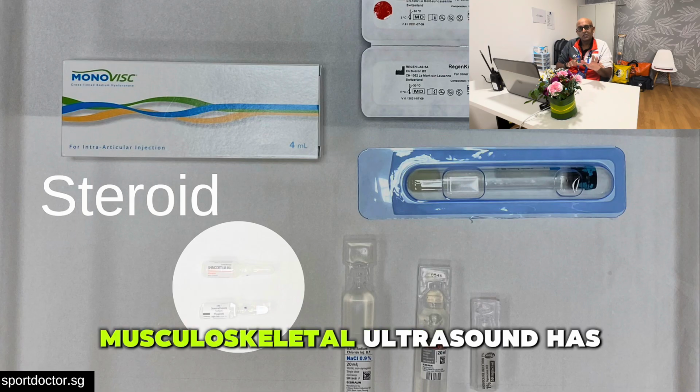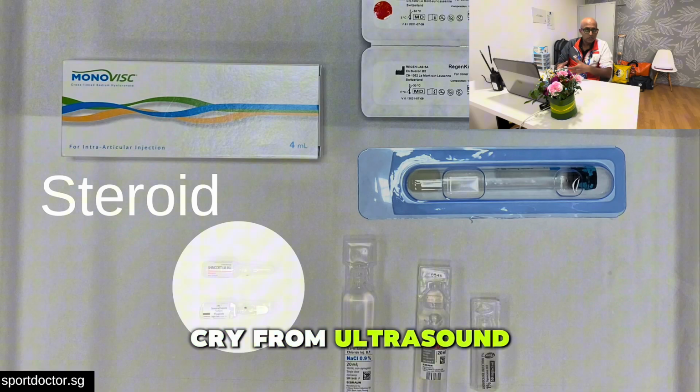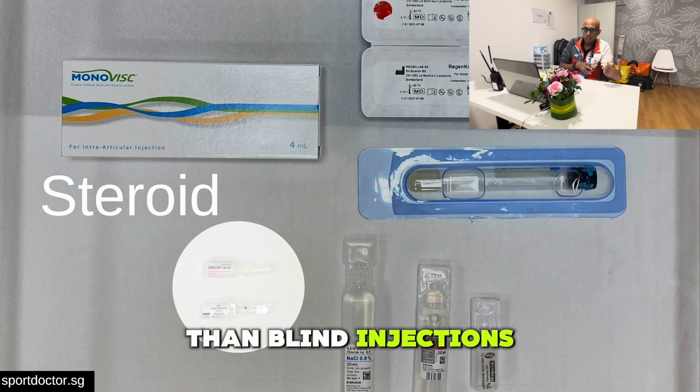This is where musculoskeletal ultrasound has really made many changes. There's lots of evidence to say that doing blind injections is a far cry from ultrasound-guided, and you can really place the steroid in a better location using ultrasound guidance than blind injections.